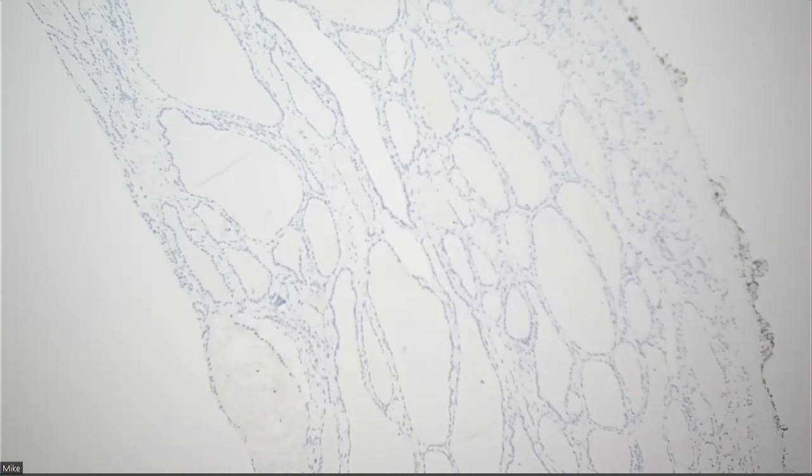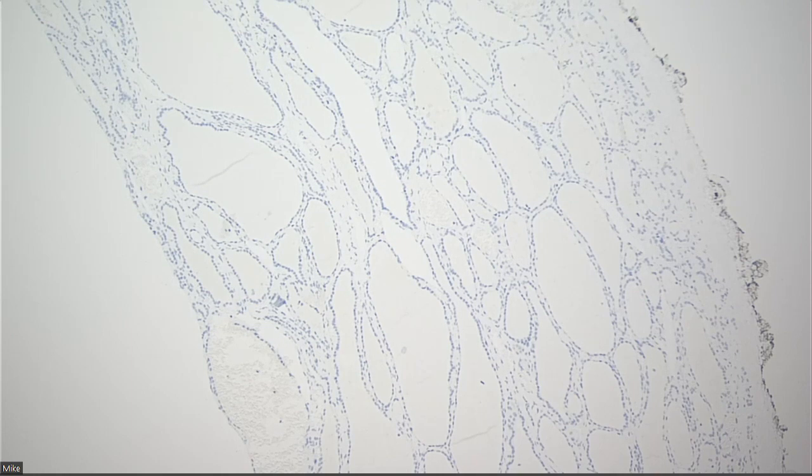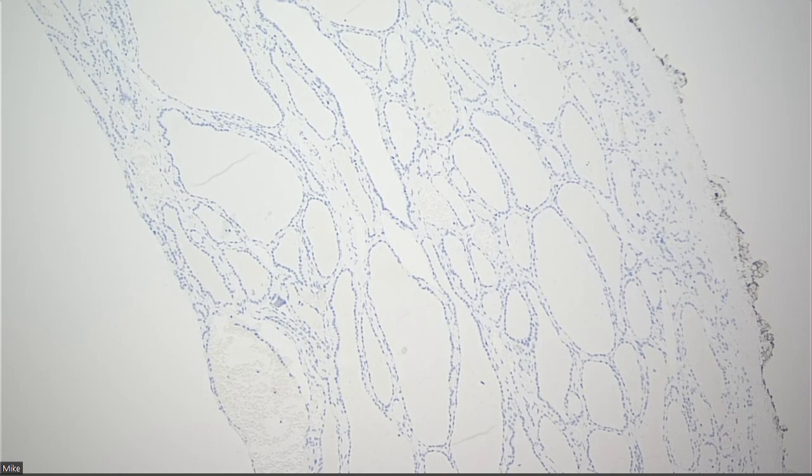And in fact, this had BRAF V600E on molecular. Now the stain, Dr. Venkatraman modified the dilution to make it stronger because this wasn't picking up the hematologic malignancies, because I guess the amount of protein was probably less in those cells.